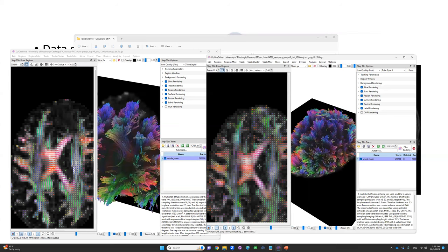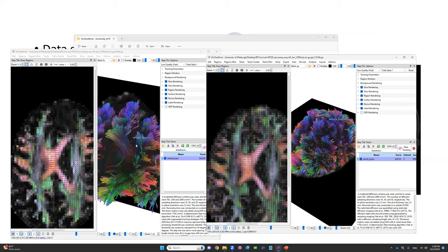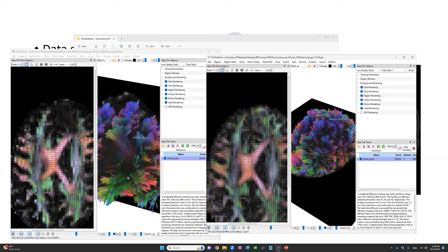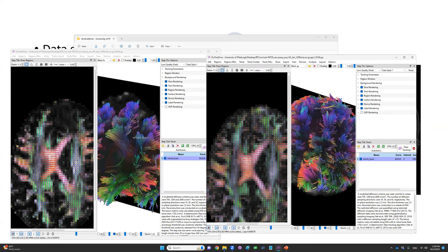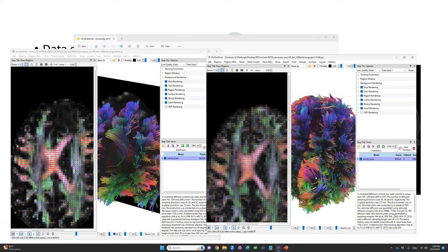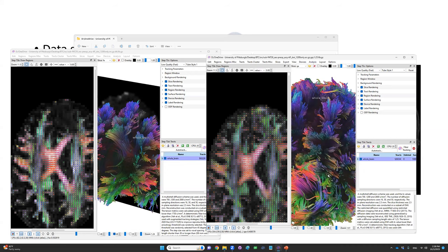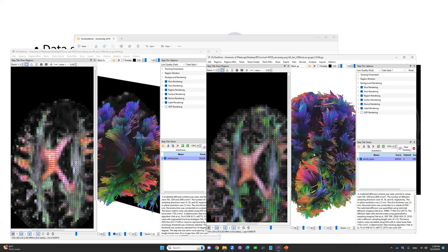For this case in the frontal lobe, perhaps it doesn't really matter which picture you see going in. But imagine if you were operating a tumor in the occipital lobe where optic pathway really matters. If you look at DTI tractography, you could end up with a larger resection taking out a big chunk of fiber. As opposed to GQI tractography, you may keep those fibers that can be functionally critical.